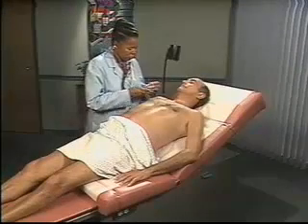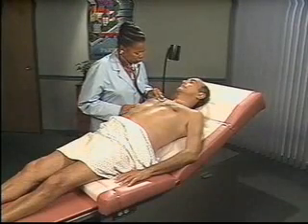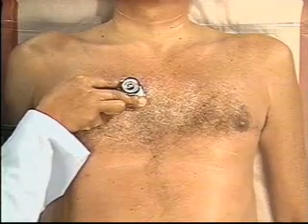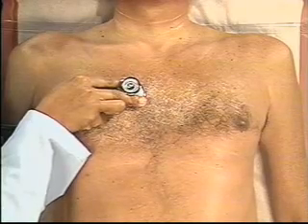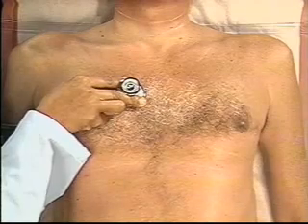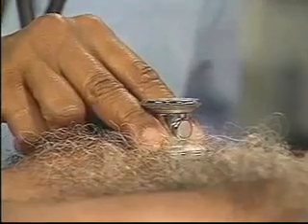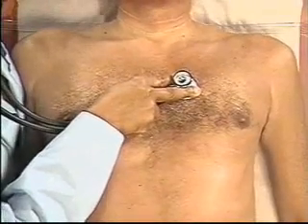Now that you've seen the listening areas in sequence, focus on the heart sounds in each area. S2 is usually louder than S1 in the aortic area. Please breathe deeper than normal. S2 is usually louder in the pulmonic area.